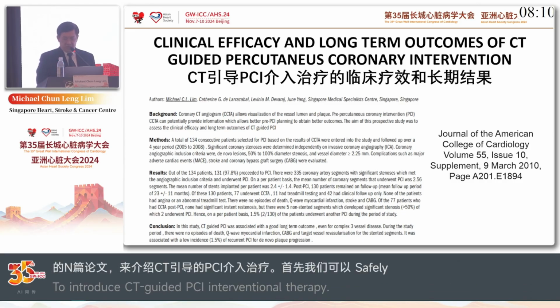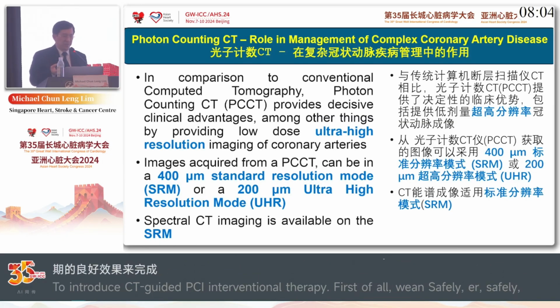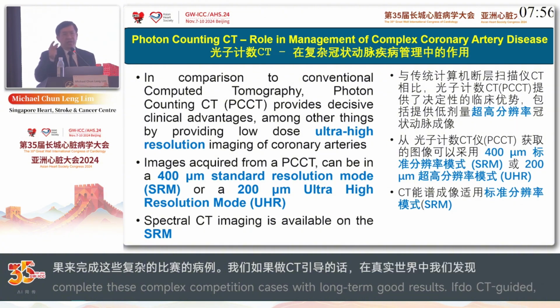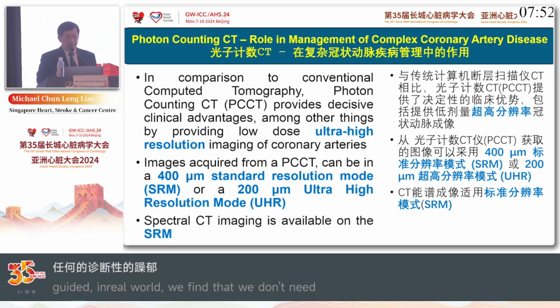Since then, I've always believed that for every case where I intend to do a procedure, I will do a CT first. And in real world practice, I find that I don't need to do any diagnostic angiogram. So I hardly ever do a diagnostic invasive angiogram for the sake of doing an angiogram.